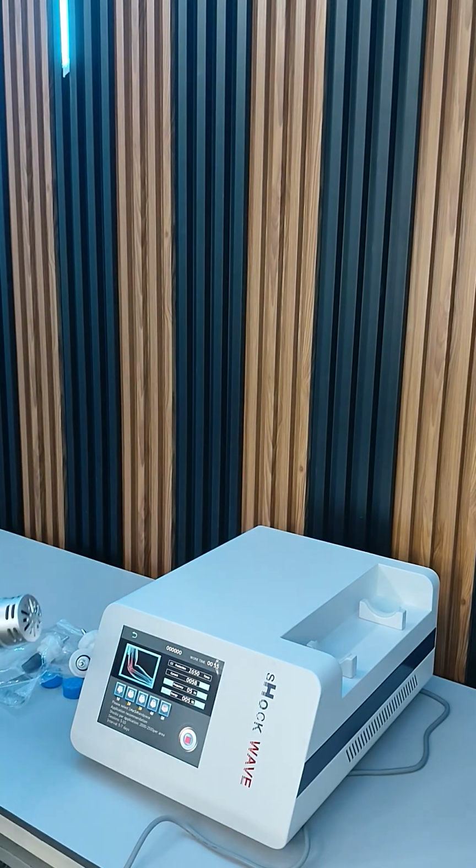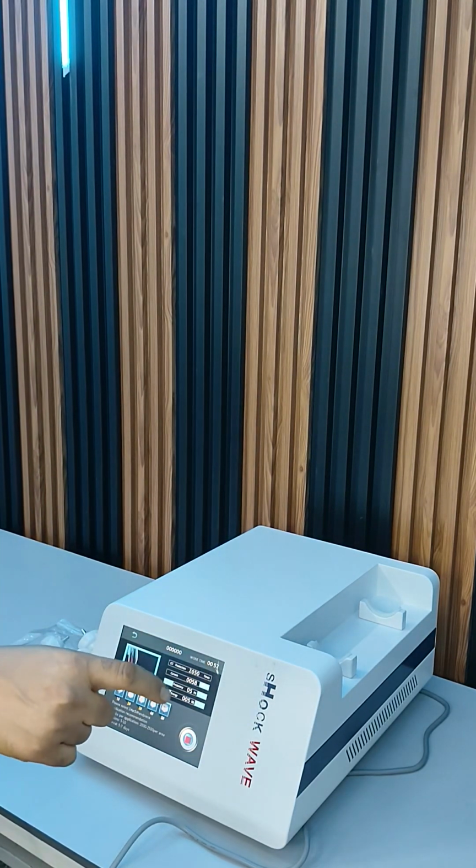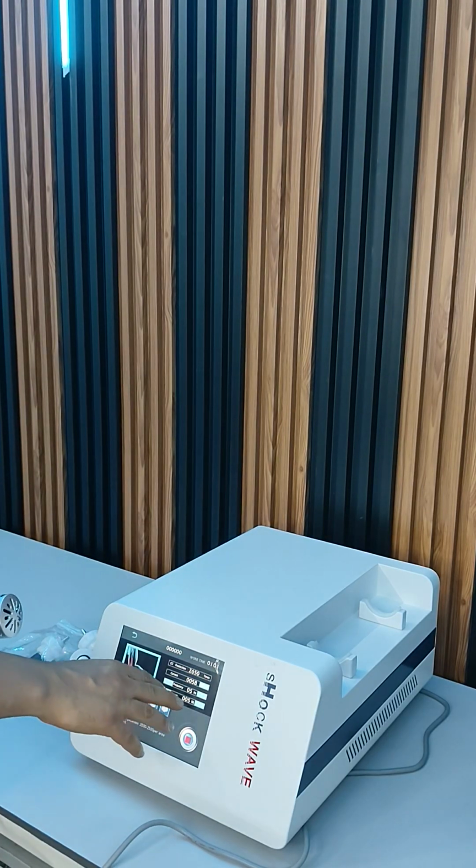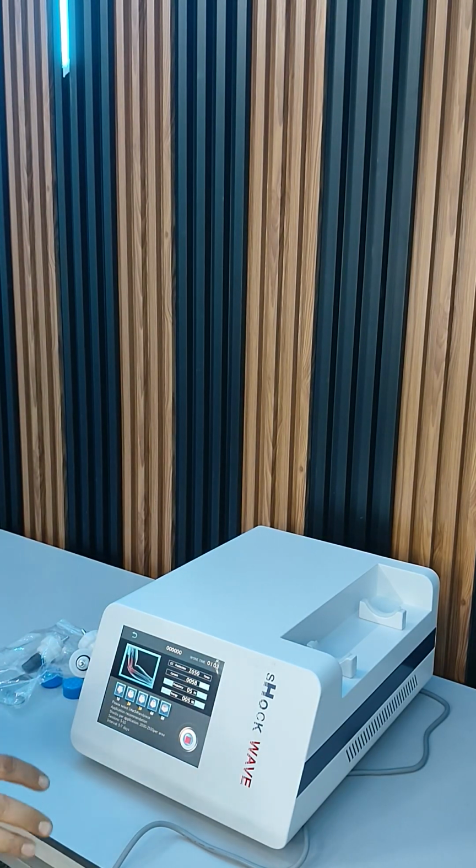That is why, at the maximum frequency, you have a limit in the energy section, because 5 millijoule is the minimum limit here, and I am feeling quite enough energy in the field. If I select the maximum frequency and the limit is like 200, in case the joint is like the elbow or some smaller joint, that may damage the joint. That is why the limit is set at the higher frequency.